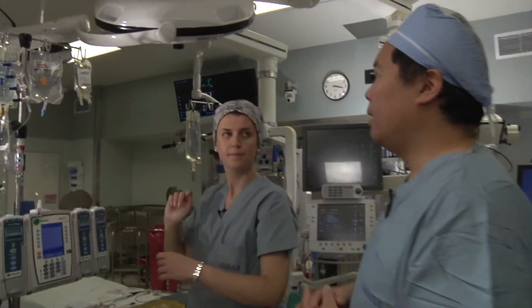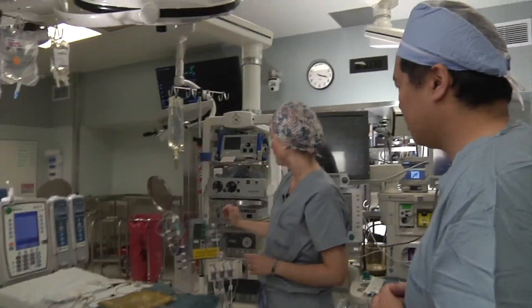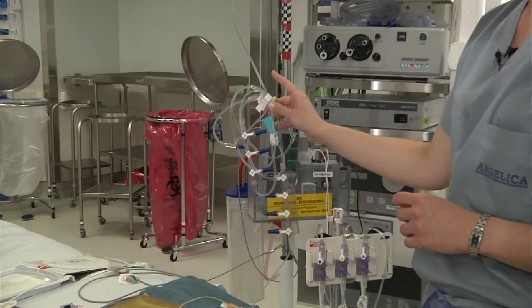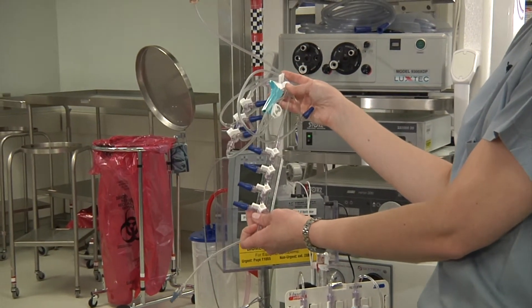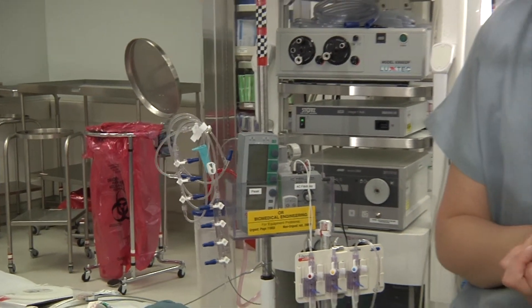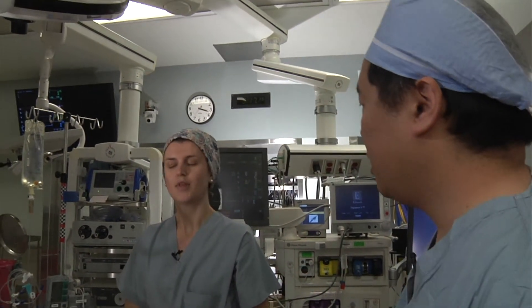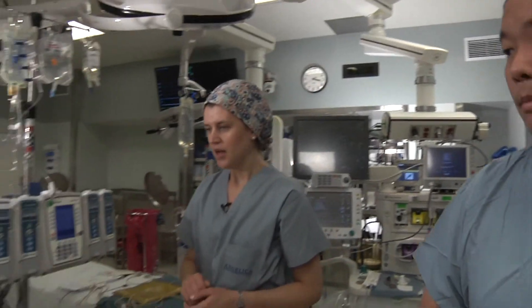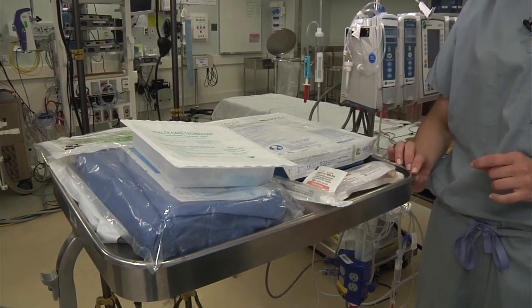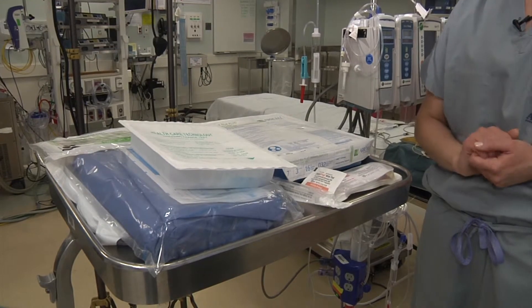Moving on to the right side of the bed, on the right pole we always have a setup for the bolus line — regular tubing with a gang of four, set up and ready to go for infusion to the patient when the central line is placed. And here we have a tray with all of the unopened supplies needed for placement of the central line.